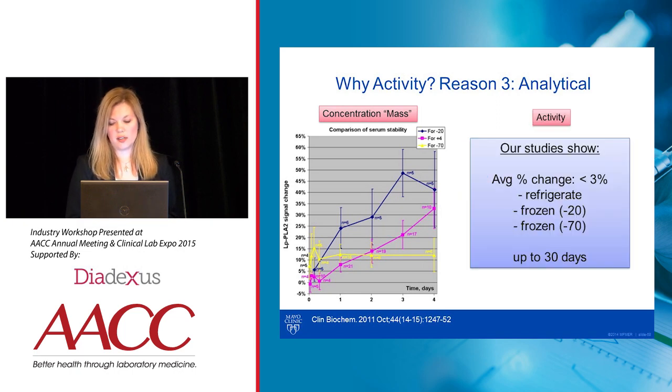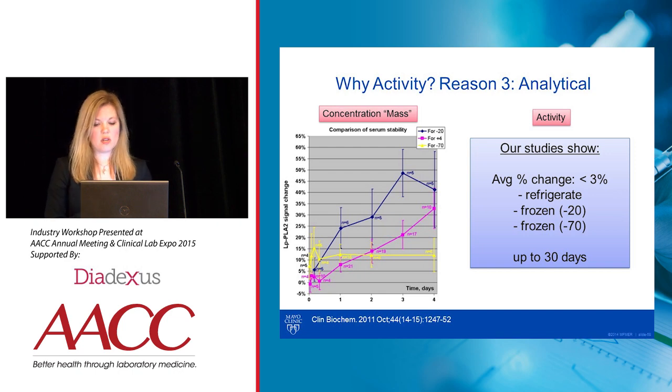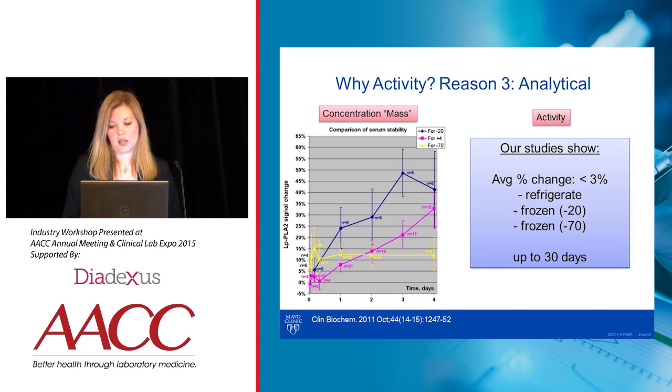So in our internal studies, I won't show you the actual graphs here because it isn't published yet, but the bottom line is that the average percent change in LPPLA2 activity is essentially unchanged in conditions of refrigerated or frozen storage, and we've tested this up to 30 days now.